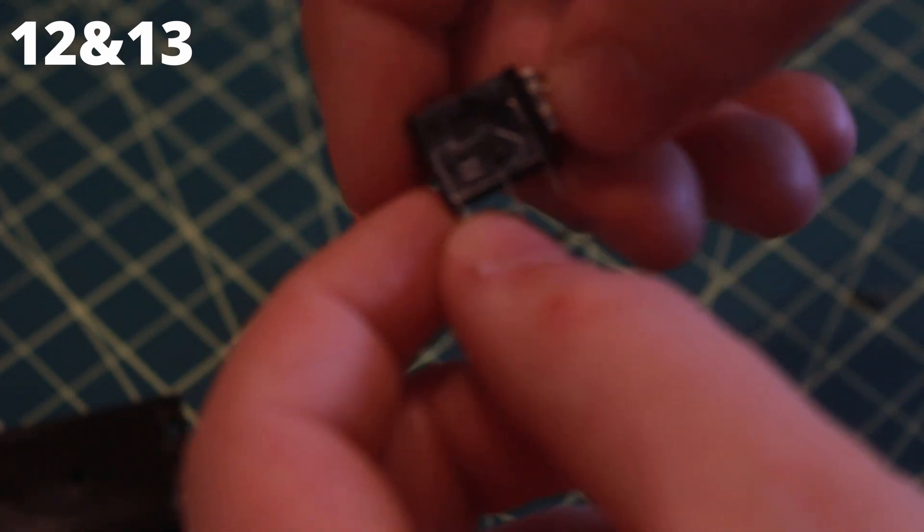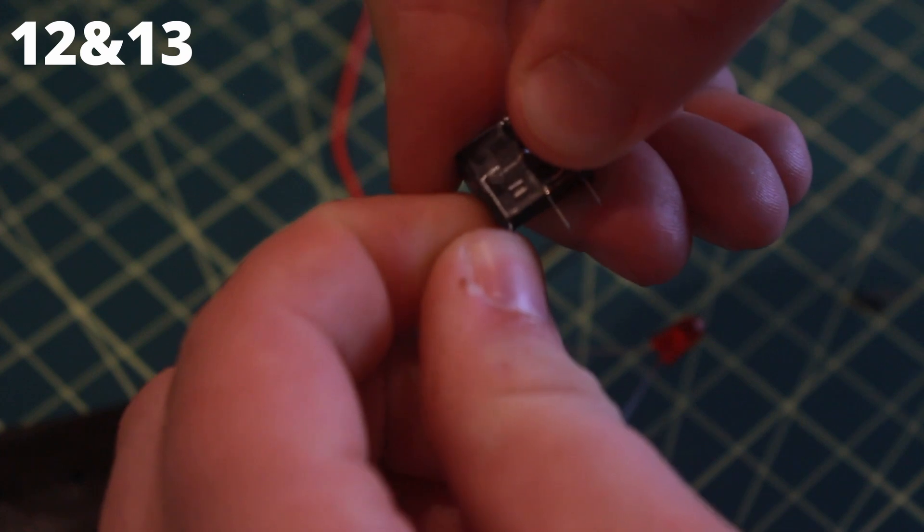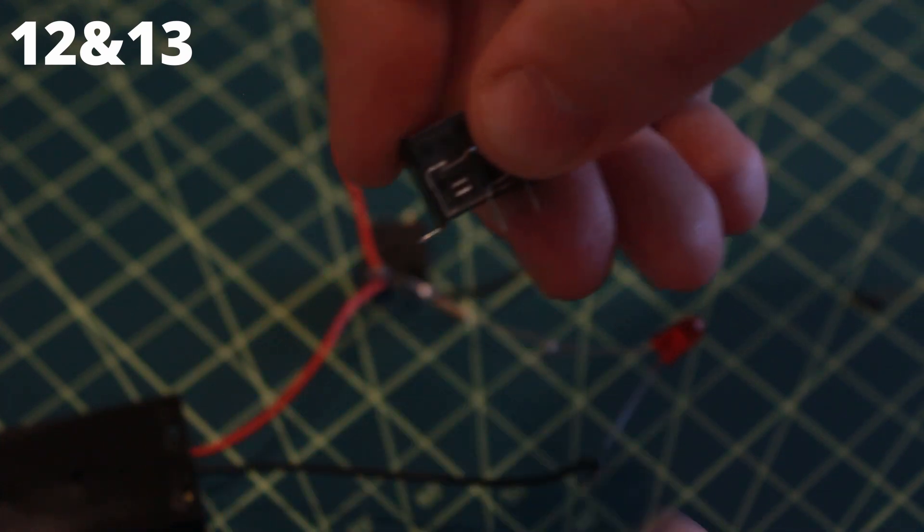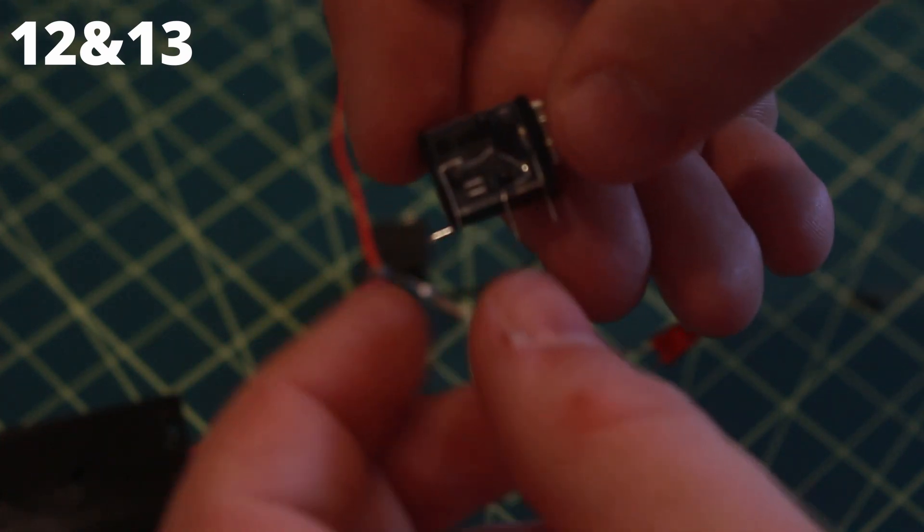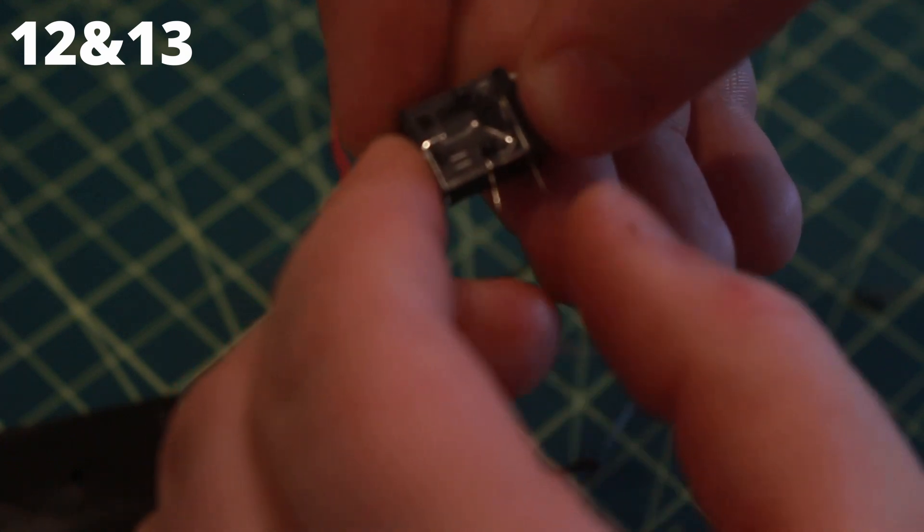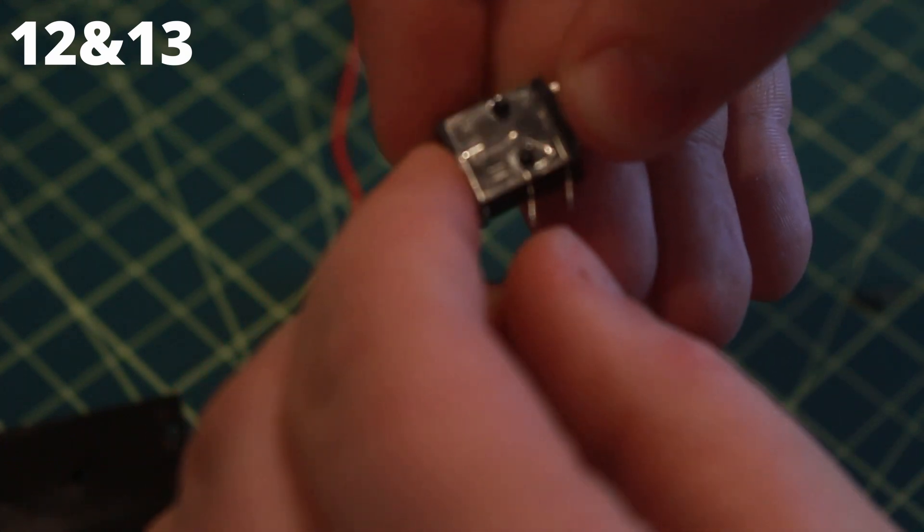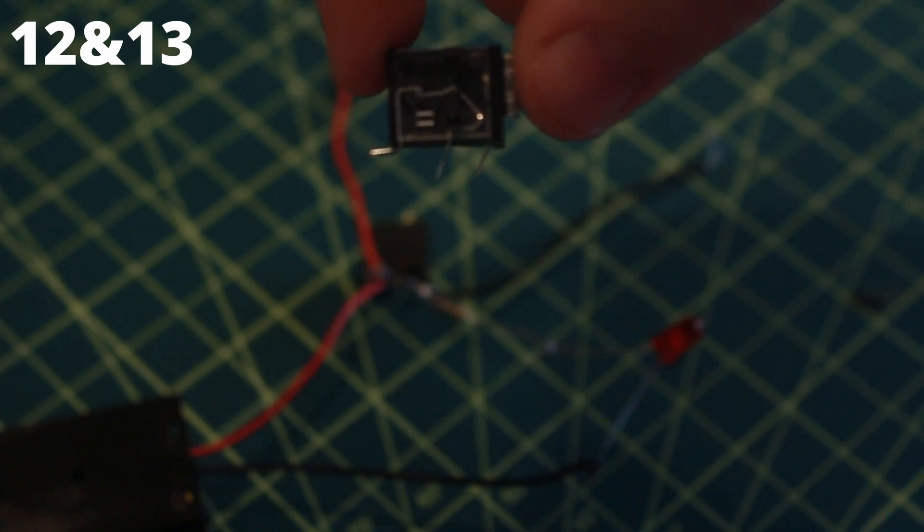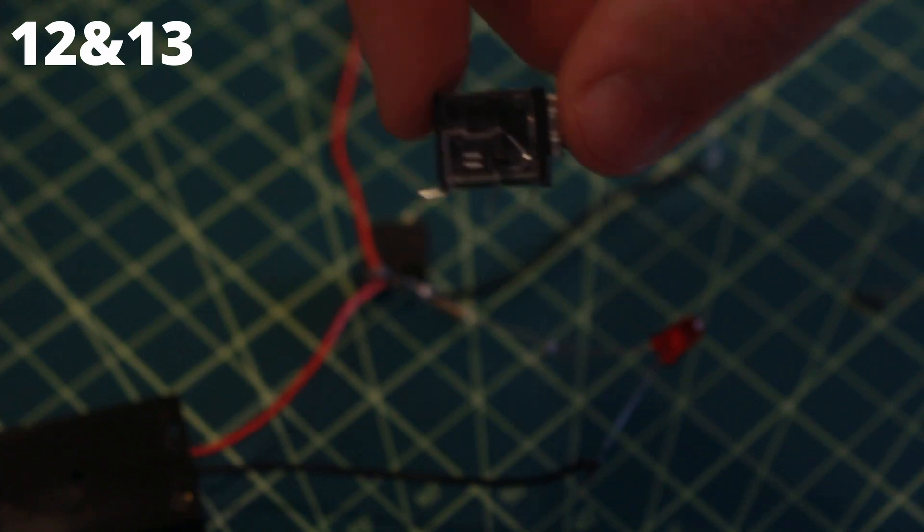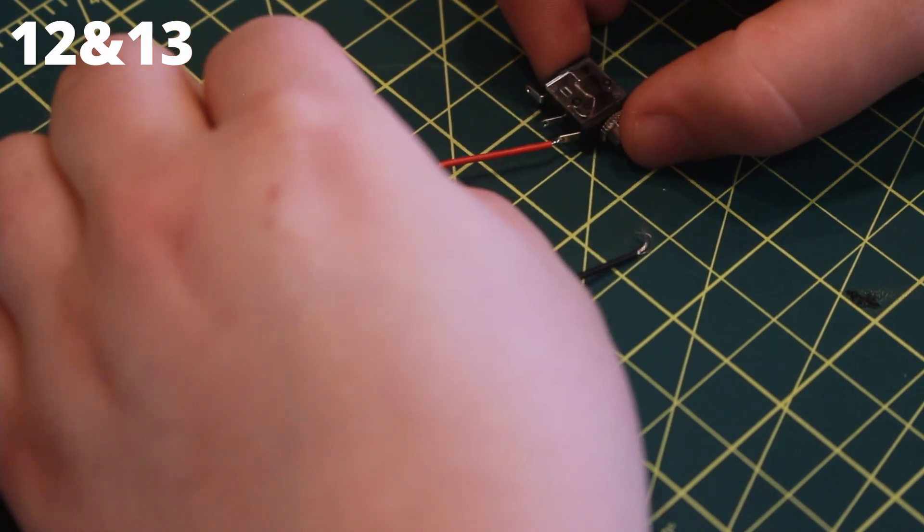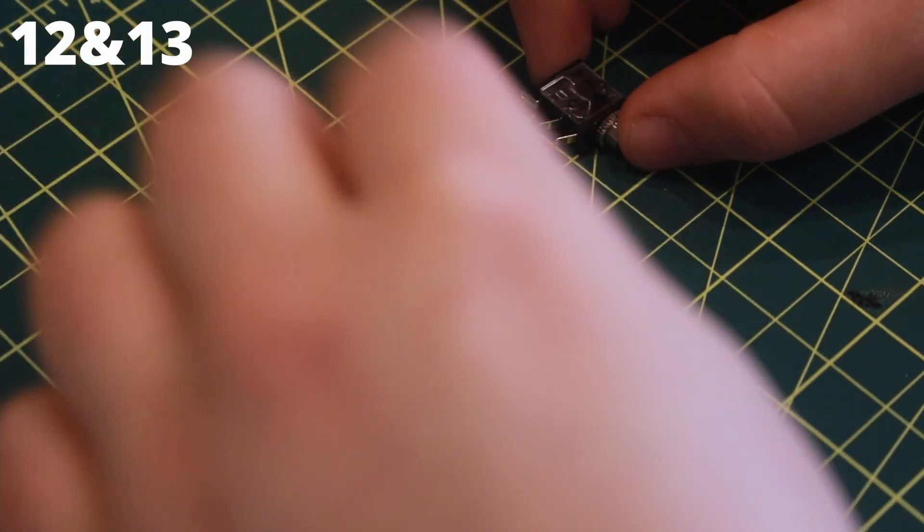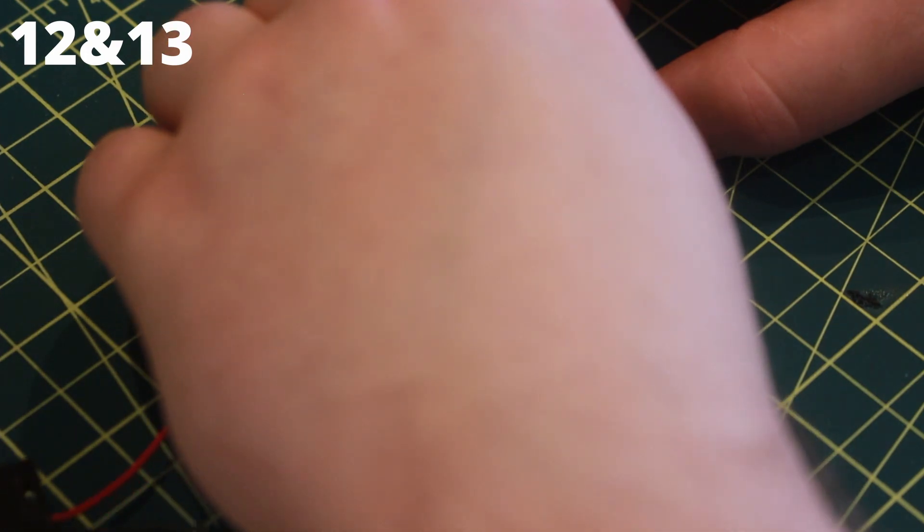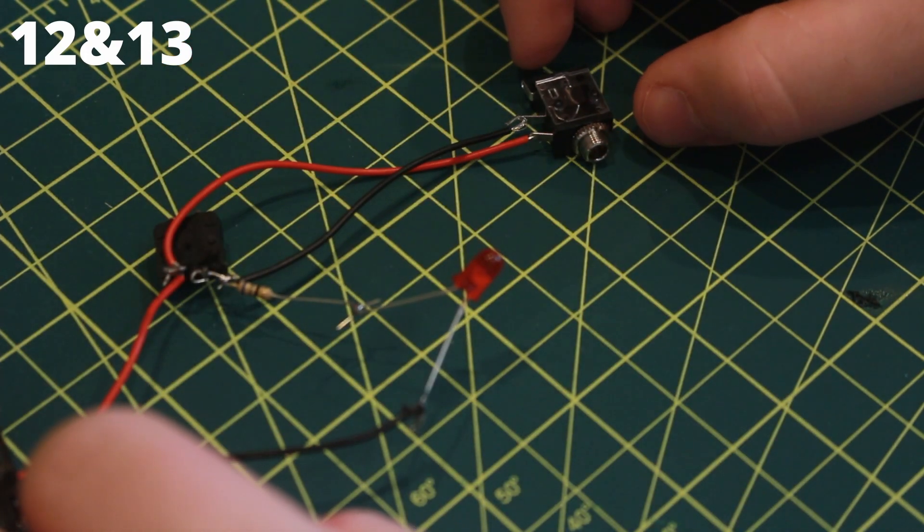Take the 3.5mm jack and bend the lead farthest from the port at 90 degrees. Then bend the other two leads at a 45 degree angle. Take the loose red wire and attach the lead closest to the port and attach the loose black wire to the middle lead. Solder these in place.